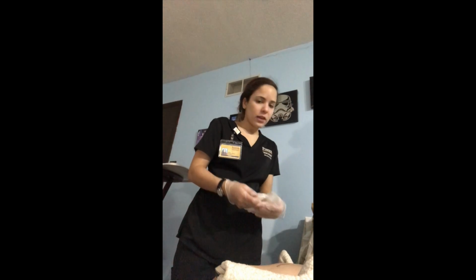Okay, and when we remove it, we need to check the dressing, and we need to see the color, if there is any drainage in the dressing, and the smell.